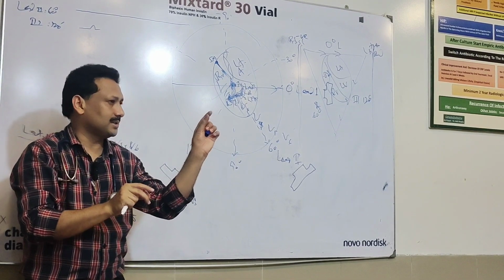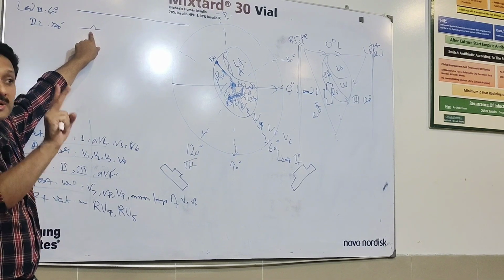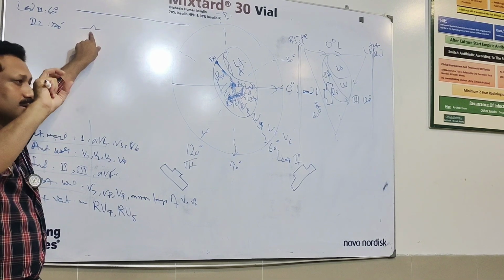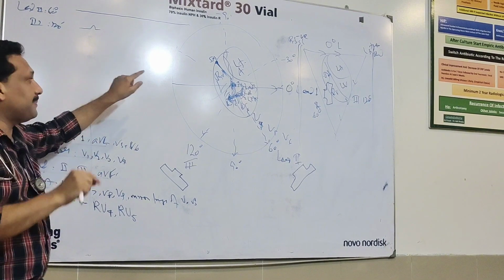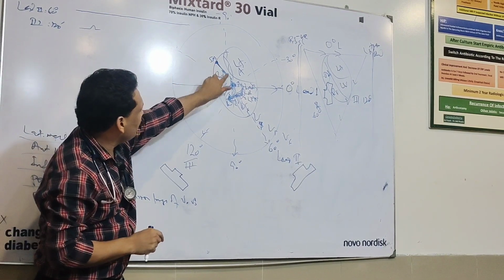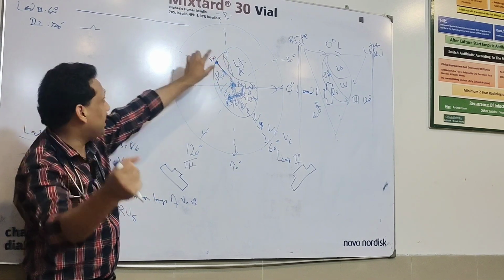These are small in size, so there is a small deflection on that ECG paper. Understand this good concept: small size, so small deflection. This is the atrial depolarization wave. What is happening next? The current is going from the SA node to the AV node, and during that process the atria are contracting. And this is the waveform.